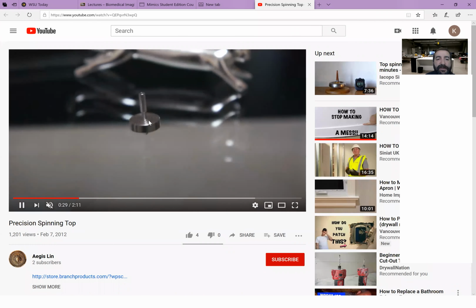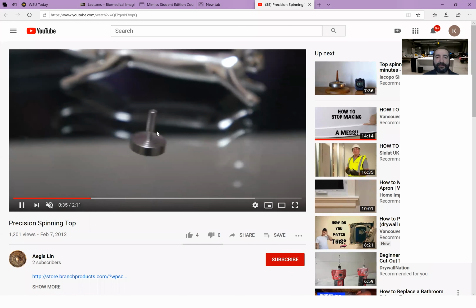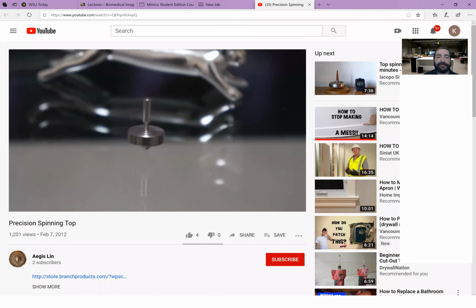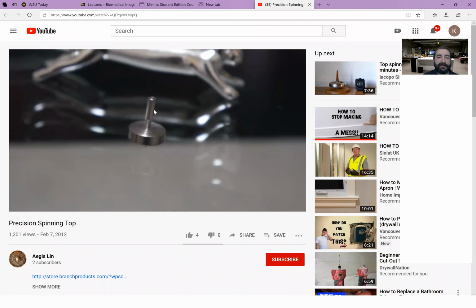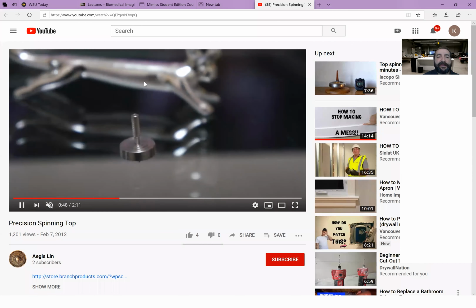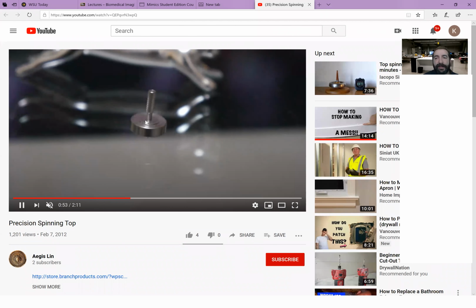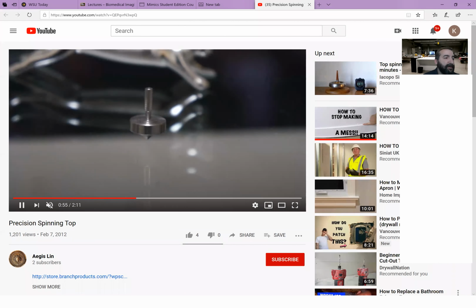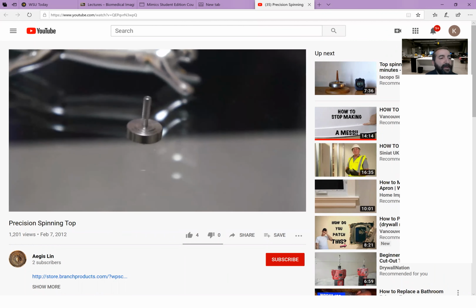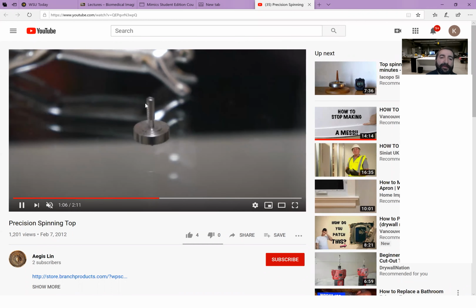See how it wobbles? It doesn't just sit there and spin perfectly. Instead, it wobbles about. Most of you have probably seen this before. Maybe you've even done this yourself with a spinning top. You see how it doesn't spin just perfectly? This is because there's an external gravitational field pushing down on it, and it's spinning. So it has this force being applied to the spinning object with angular momentum. It produces a directed force at right angles, which causes it to wobble.